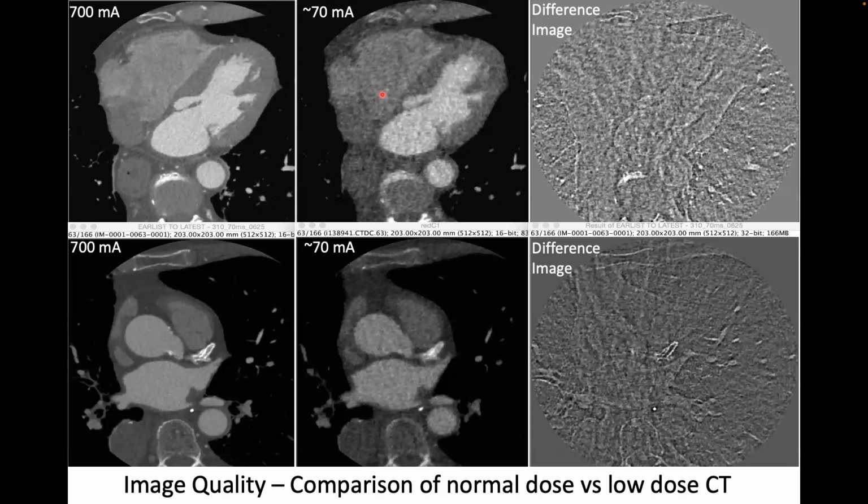So unlike MR and other places where all of this is pretty simple, in CT you have to be careful. You can't just measure signal to noise as your only image quality factor. It doesn't work, okay? You can see that here when we have a feature in this image at 700 mA and 70 mA, and you look at the background, it's not just noise that's the difference between those two pictures.